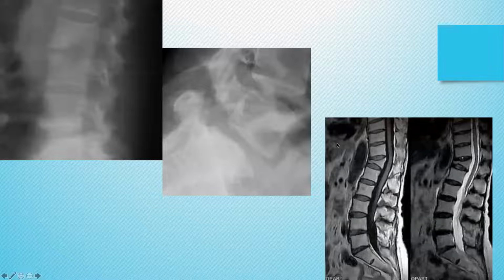So you see a comparison here of the various details that we can get. And as I said, for spinal issues, especially in trauma, doing a plain film first is not a bad thing. But if you have not answered your question, you go on to more detailed investigation.